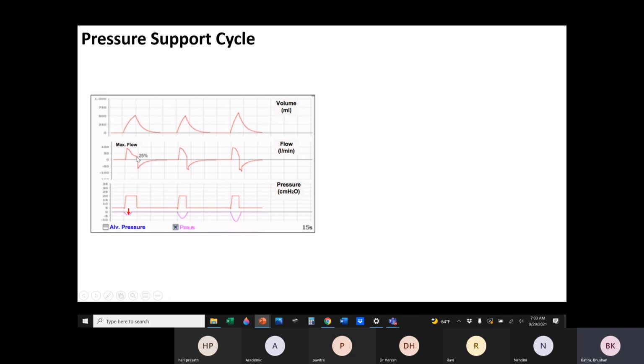So the patient triggers the ventilator cycle. And this cycling is also kind of determined by the patient is the argument here, because as the patient breathes in, the negative pressure generated will generate more flow. The higher the peak flow generated by that negative pressure, the more different will be the value here, which would mean that the cycling will depend upon the peak inspiratory flow. If the peak inspiratory flow is lower, then the cycling will be at a lower flow.